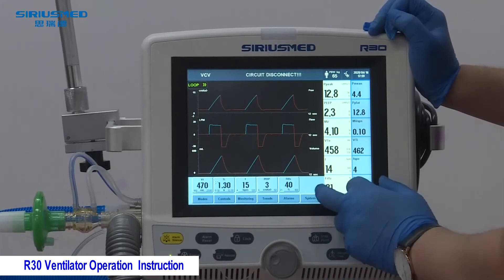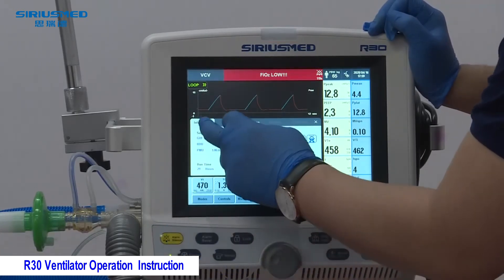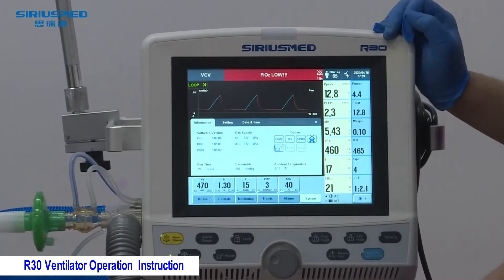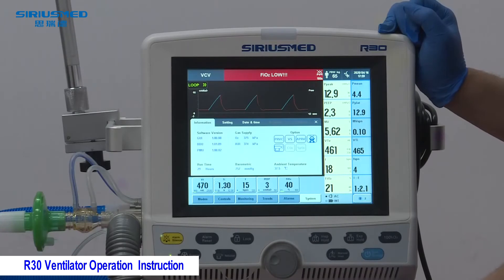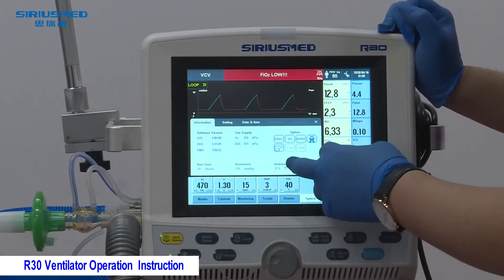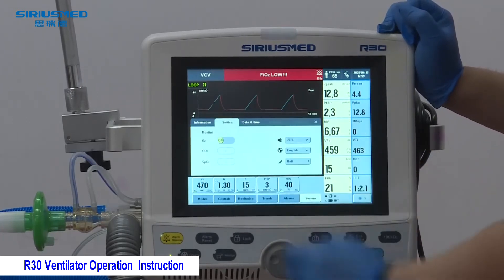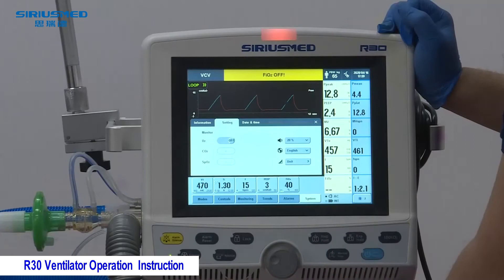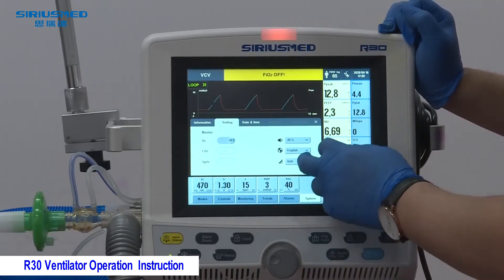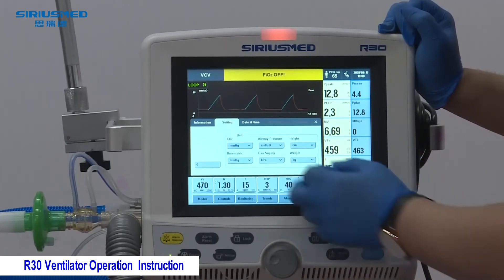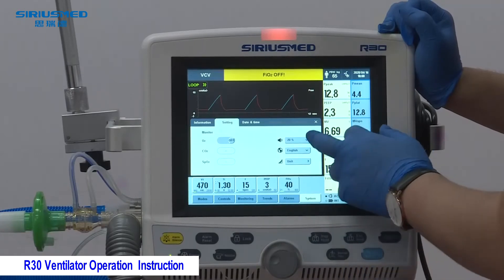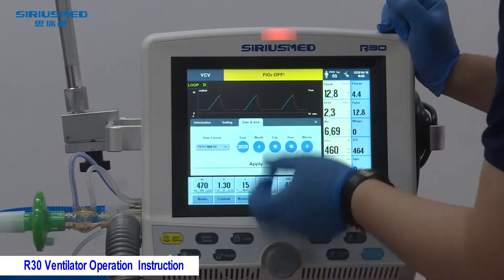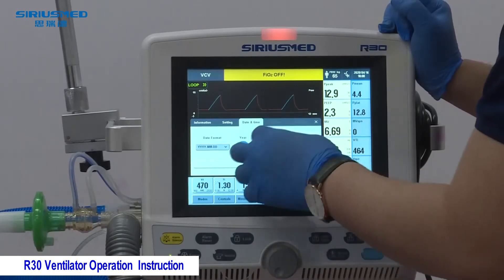In the System section, you can see the software version, runtime, and gas supply pressure — we suggest between 350 to 500 kPa. You can also see barometric pressure, temperature, and optional functions. Under Settings, you can enable or disable the oxygen monitor, CO2, and SpO2 — these are optional functions. You can also set the language, the CO2 unit, and other machine options.